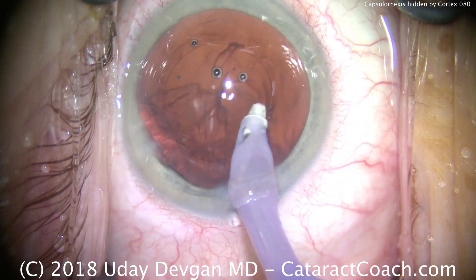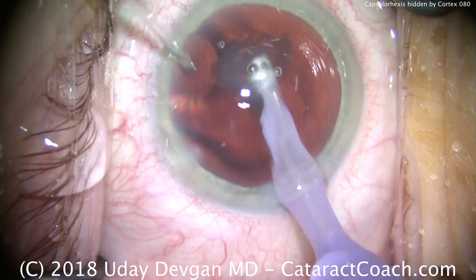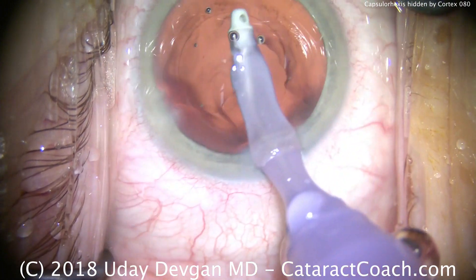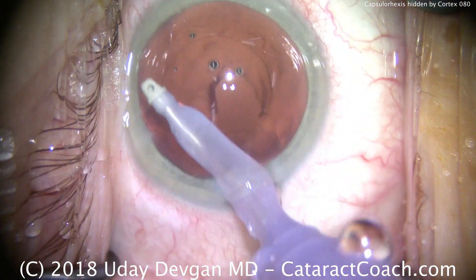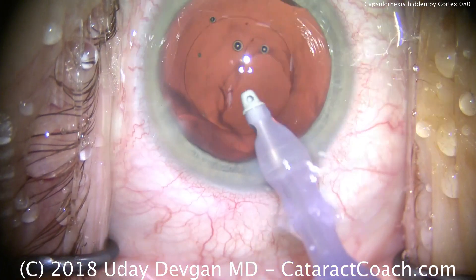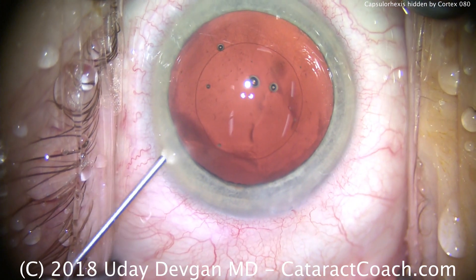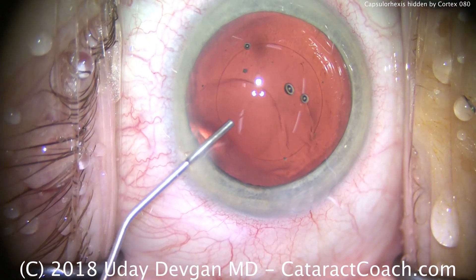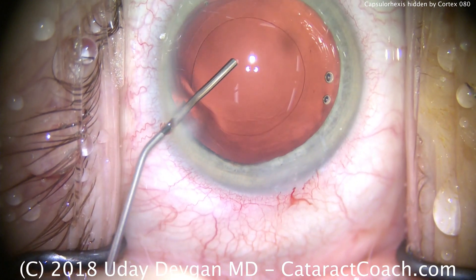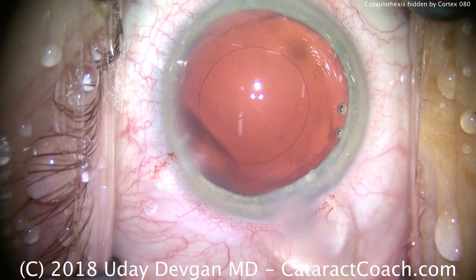Cortex is being removed now in the subincisional space, and it's looking pretty good. In this case we'll be putting in a monofocal single-piece acrylic lens with aspheric optics, targeting emmetropia or plano post-op. We're filling the capsular bag with our cohesive viscoelastic — there we can see the outline of our rhexis, which looks great, nice and round. We certainly didn't need to use the half-million-dollar femtosecond laser.